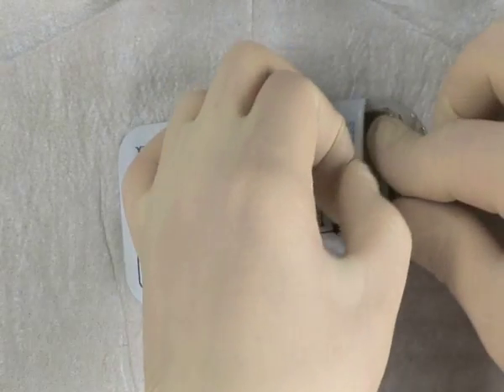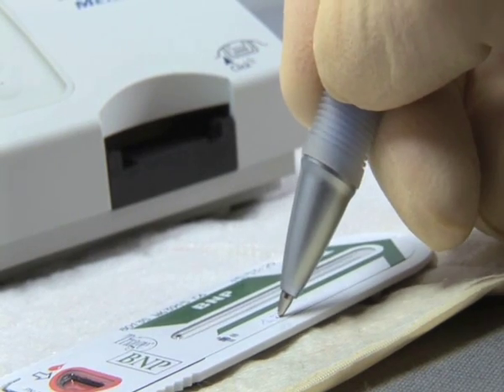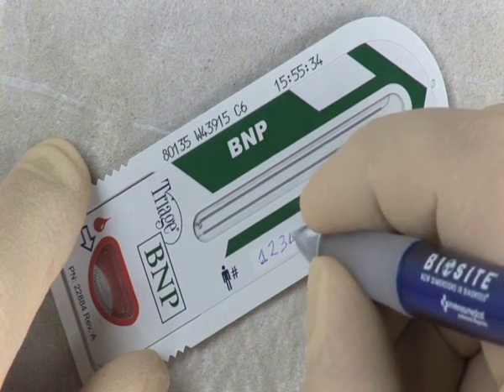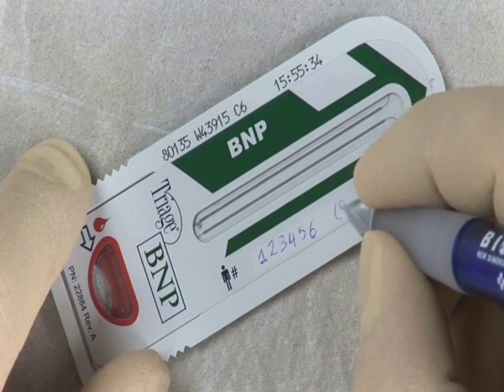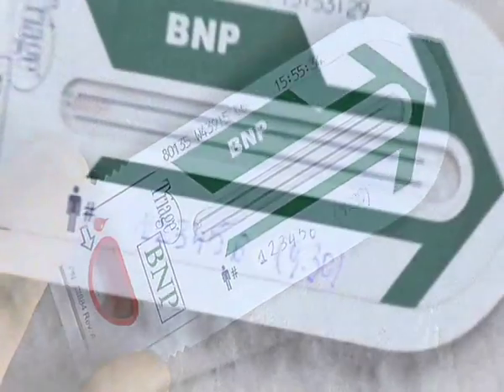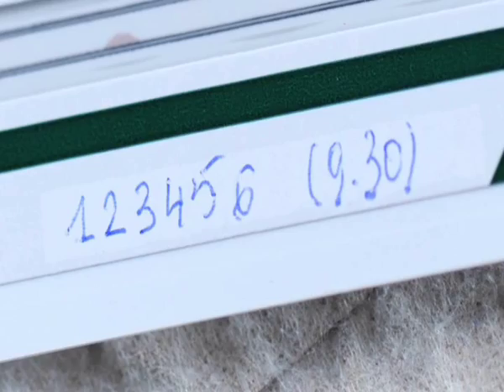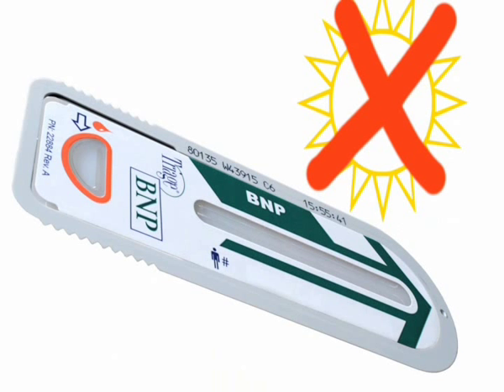Open the foil pouch that contains the test device. Write the patient identification information on the ID line with a permanent marker to properly identify the patient. You may also want to write the time of inoculation on the device to ensure that the test device is measured within 30 minutes of inoculation. Also, keep the test device away from strong direct sunlight in order to prevent influence on the fluorescence.